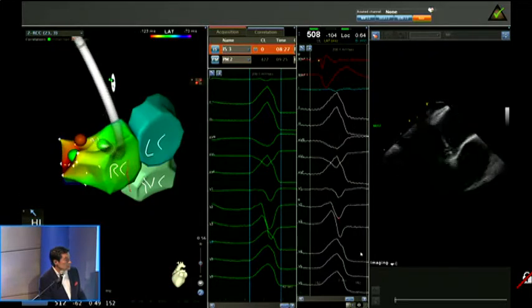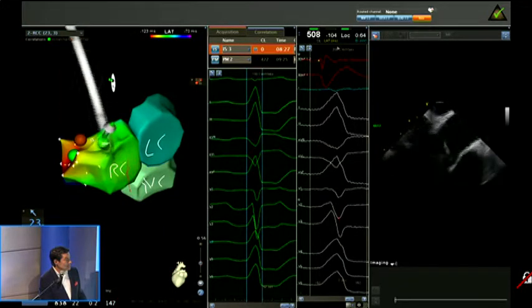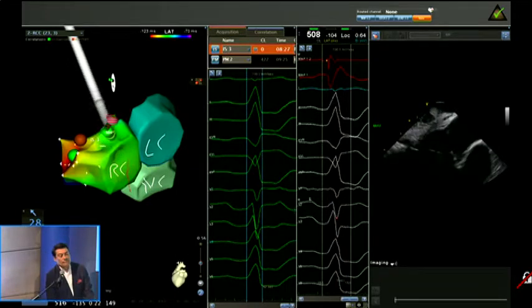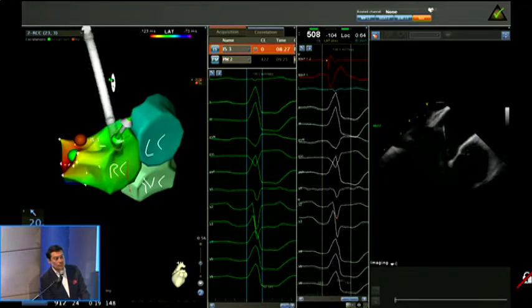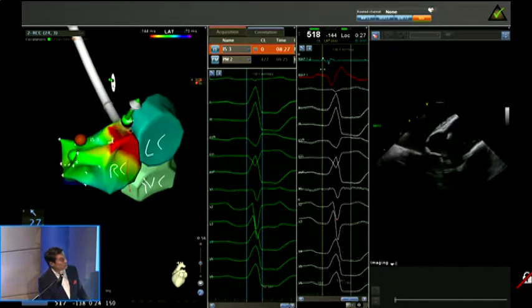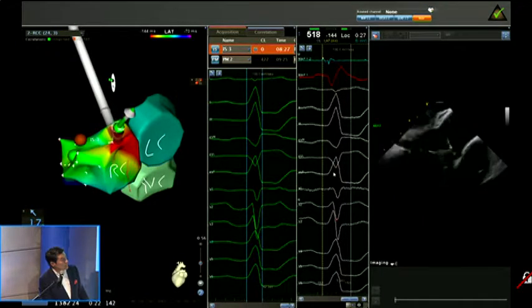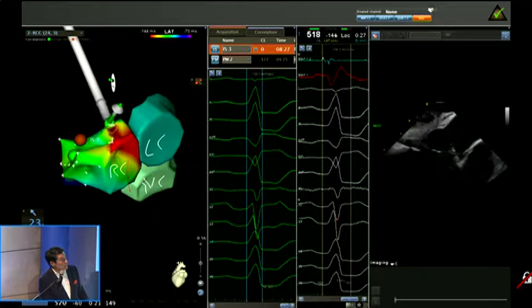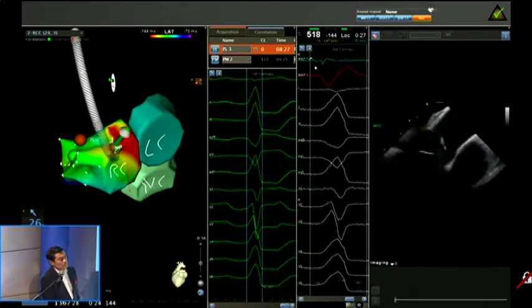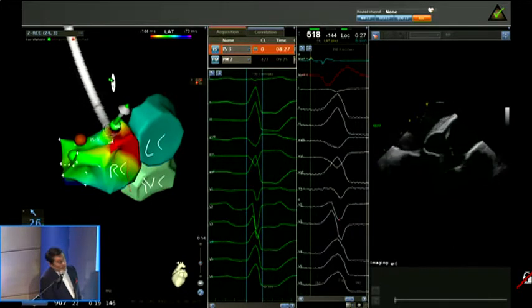I would also agree, yes, that you should have started on the left side and not look at the right, because a very clear exercise has been done. The EKG will always be the basis for the approach. That area, specifically the level of earliness, because of the thinning of the tissue, because the tissue is thin and it's only fibers, should be less than if we were on the right side. If we have all the criteria, the application would be there.